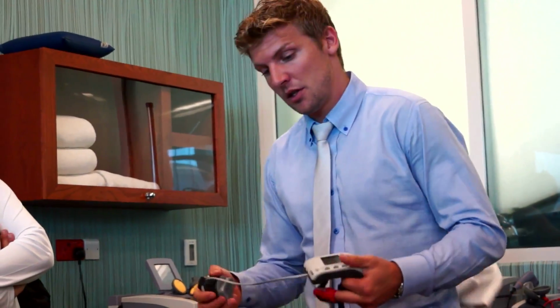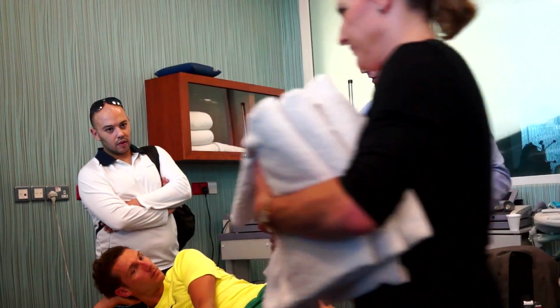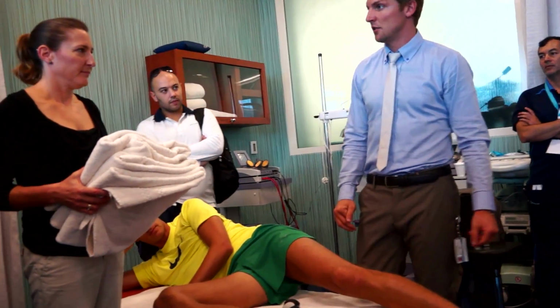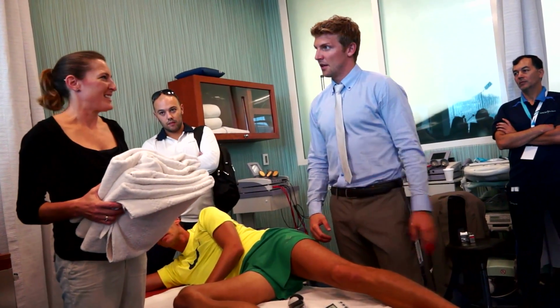Another thing is that if you're not comfortable with the measure, then do it over. Just tell the patient, don't note it down, and don't be too nice with the patient. Just tell them, all right, you've got to do it right, and then take the test again and do the measure. If you forget to reset the dynamometer, just retest it. Yeah, exactly.